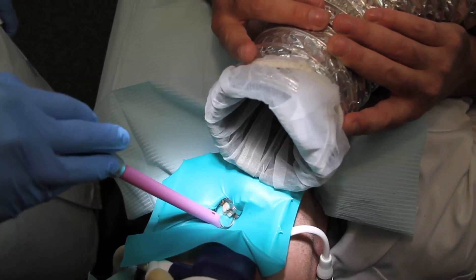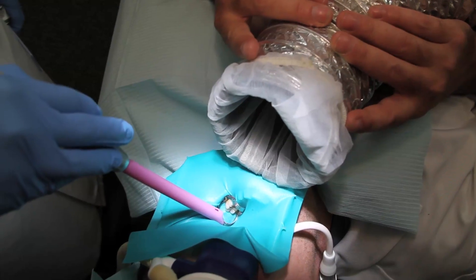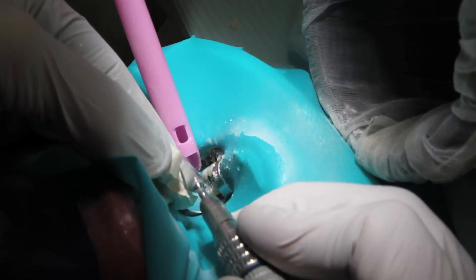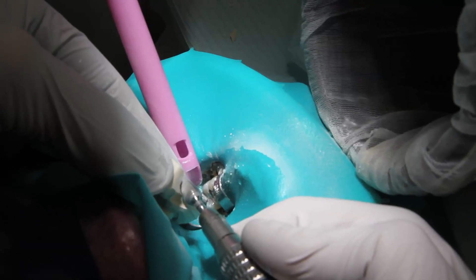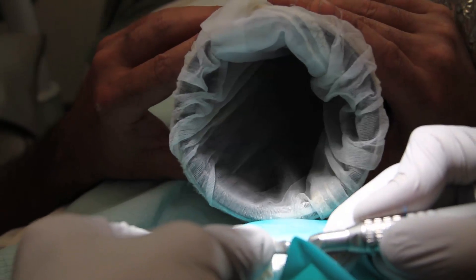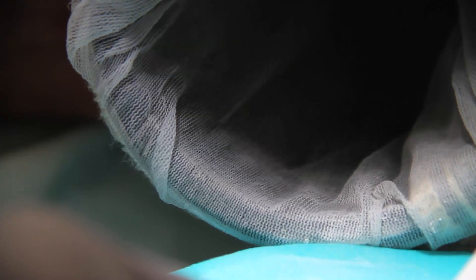There's a lot of mercury vapor released from the filling when it's drilled, and this is the most toxic part of the mercury removal. Let's demonstrate the effectiveness of the vacuum by creating dust that we can see. Here I have some plaster, and I'll drill it with a dental drill to create dust that we can see sucked into the vacuum, as if it were mercury vapor.